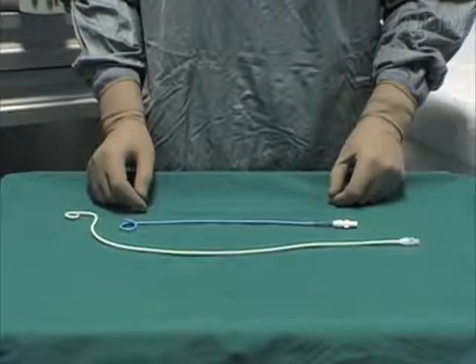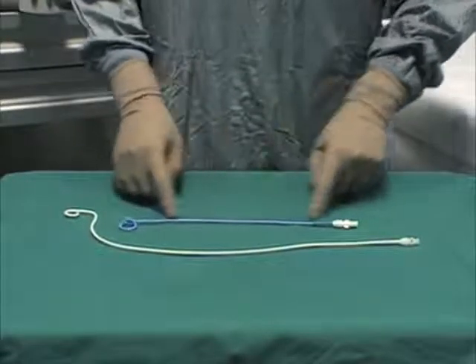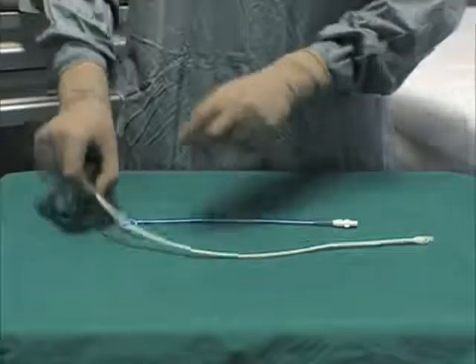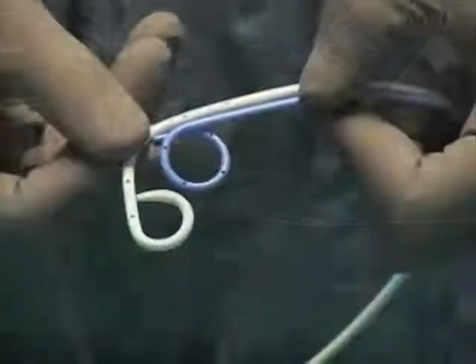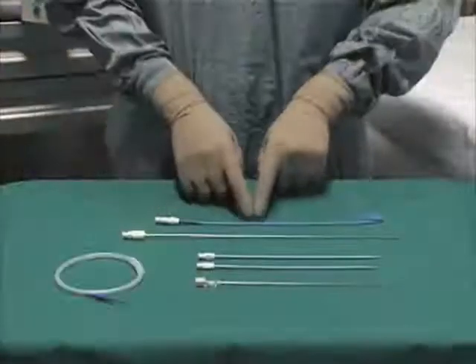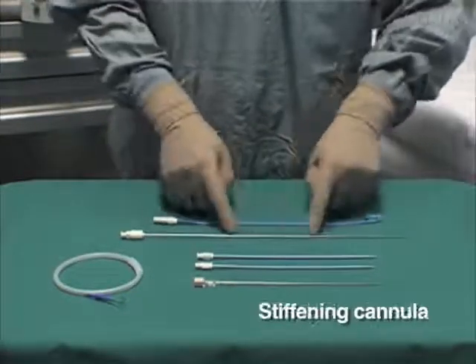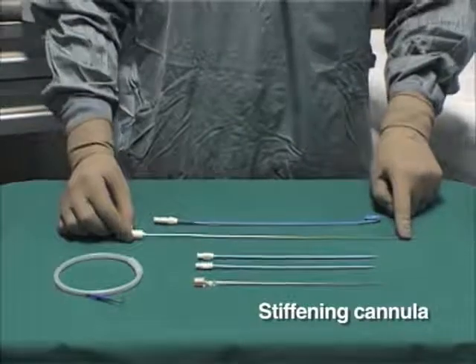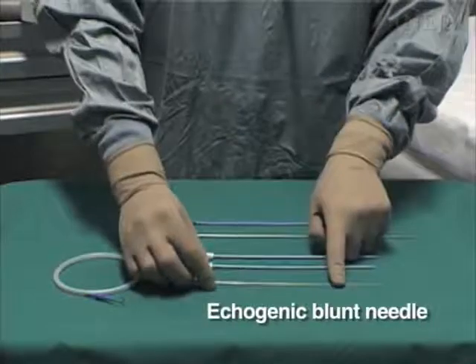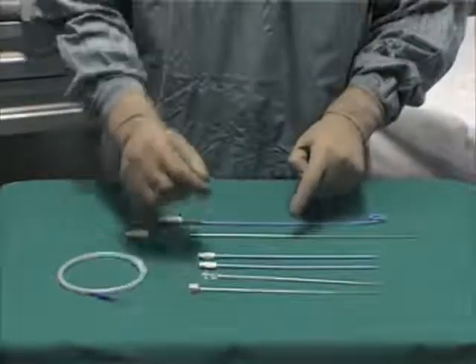Available drainage kits may vary in length and diameter of the catheter. Your selection of catheter diameter depends on the type of pleural fluid that appears to be present. A larger diameter should be preferred to drain an empyema or hemothorax. In this video, we will use a drainage kit equipped with an 8 French flexible pigtail catheter, a metal stiffening cannula, two fascial dilators, an echogenic blunt needle with a pointed stylet, and a guide wire with a J tip.